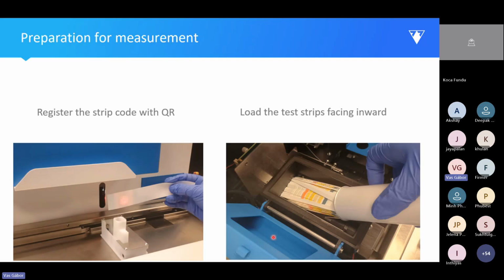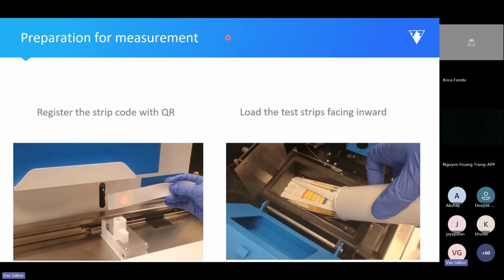And you can also place the cap of the vial here. We are going to ship 100 or 200 gram desiccant bags, a big amount of desiccant, and as I have mentioned, we have not confirmed it yet, but those are supposed to make sure that the strips that are loaded in the instrument are going to last for at least a week.